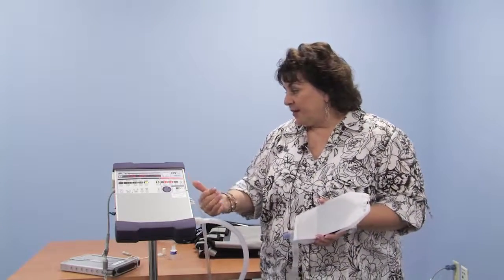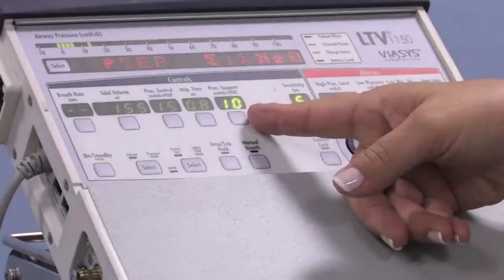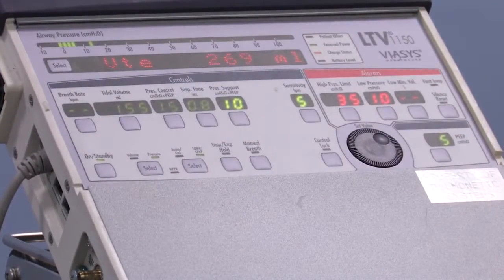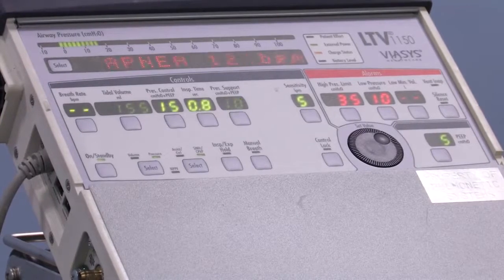So I'm going to stop breathing so that you can see that once the machine has violated the apnea time period set internally, there are a lot of internal settings because it is a computer, you will see it will alarm audibly. It'll say apnea 12 breaths. This light will go out. These lights will come on. If the noise is enough to startle the child to breathe, once they take 2 breaths, it automatically resets and goes back to the straight pressure support setting they were on.